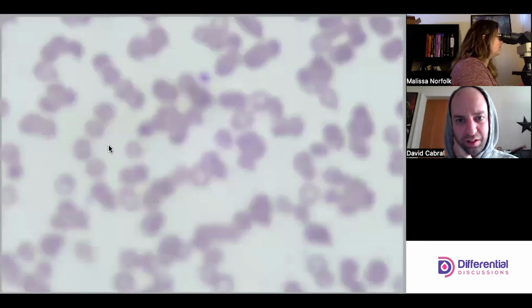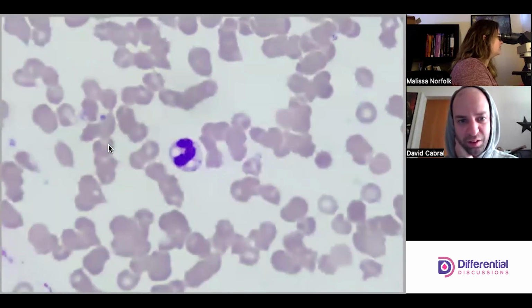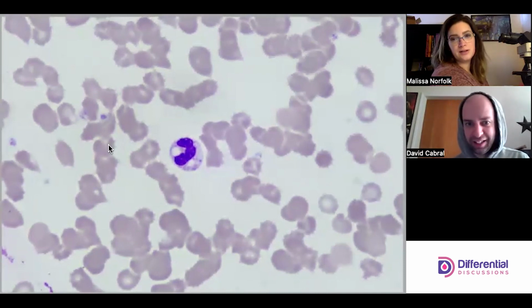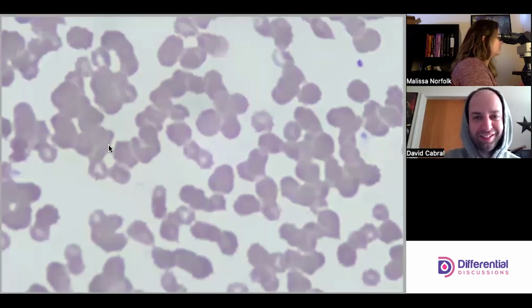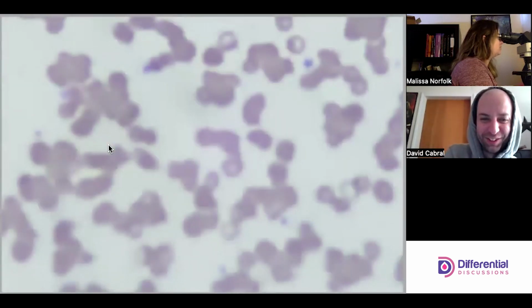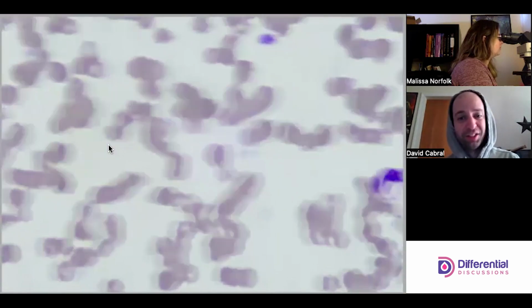Not a lot of cells, but also not a lot of good cells. Beautiful vacuoles there. I don't see anything in there either. It's tough, but this is where Döhle bodies are your worst enemy. This truly is a difficult thing to find. I imagine this patient's quite ill.